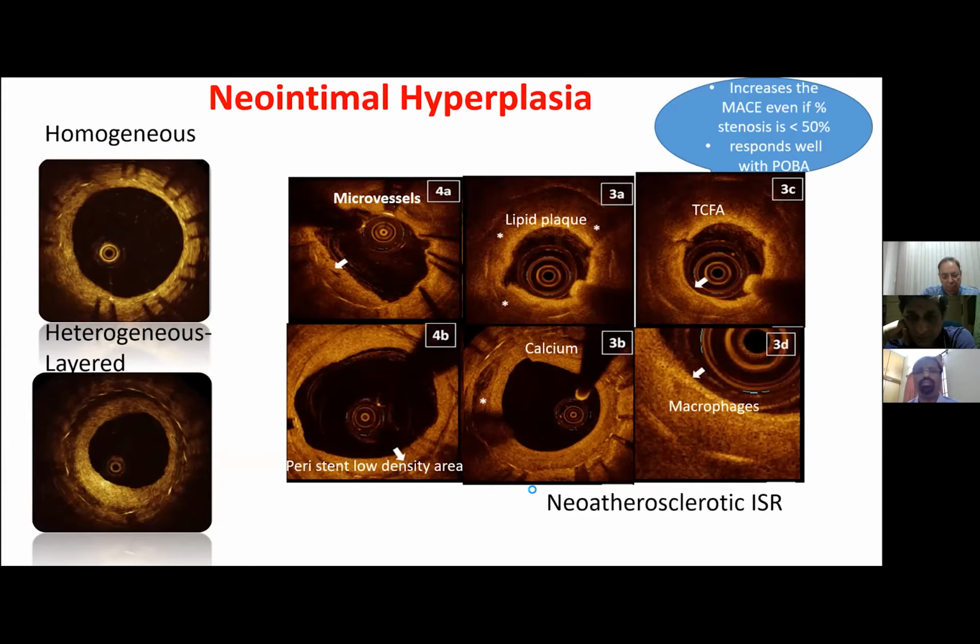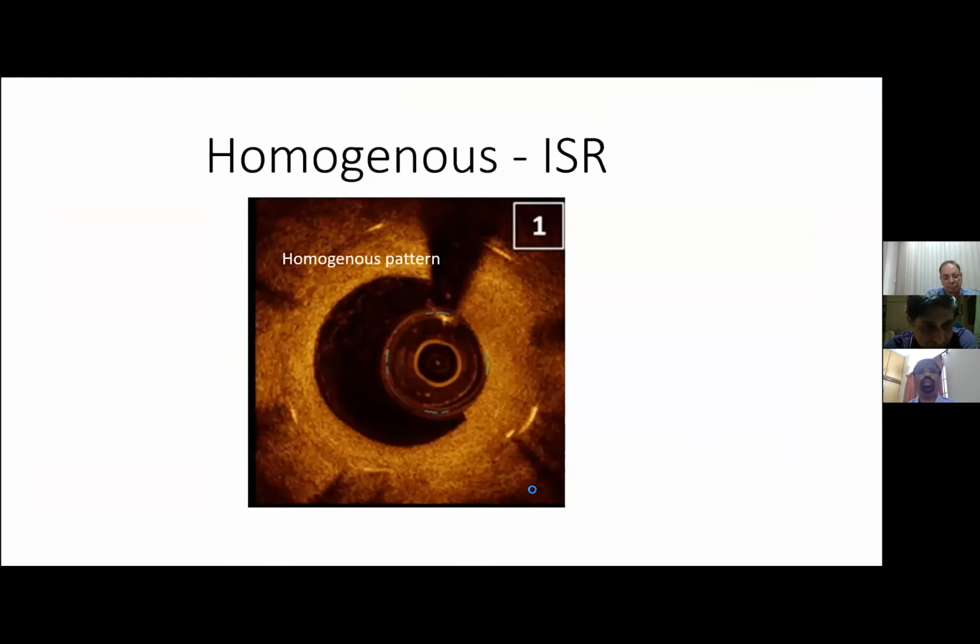Unlike de novo lesions, even if the growth encroaching the lumen looks less than 50% angiographically, one could take the help of FFR to make sure that you are intervening early in a very ischemia-prone growth. You need not intervene if it is not causing ischemia, because we all know the recurrence rate is pretty high once you keep on touching these ingrowths.